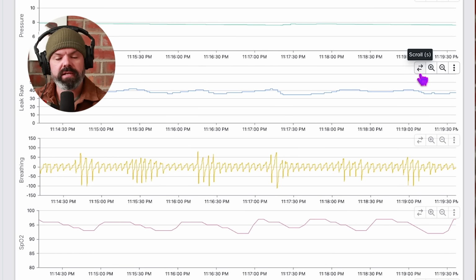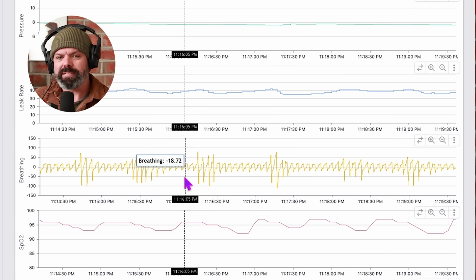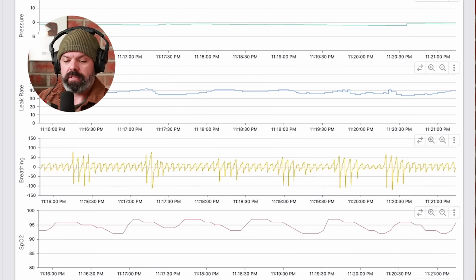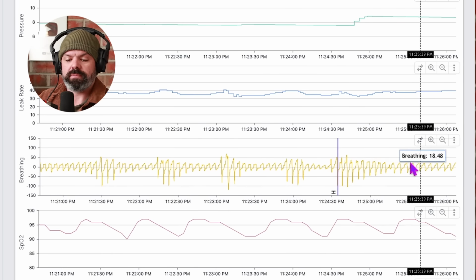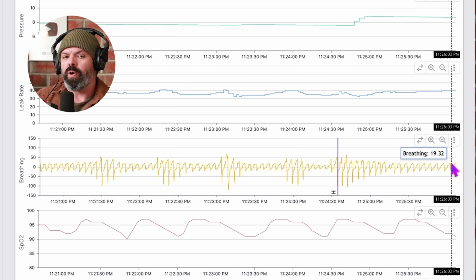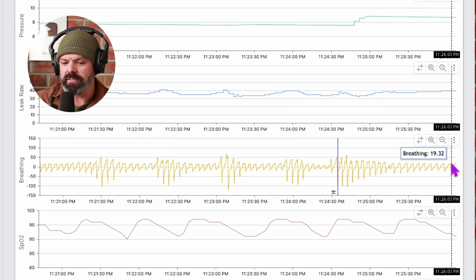I want to show you this here as well. All right, do you notice anything different now that I've scrolled forward a little bit? We've got the same breathing here. You can see the shallow breaths followed by the big breaths, but what's missing? The flags, okay? There's no more hypopnea flags. There should be one here, here, here, here. If we scroll forward, look at them. Here, here, here. They're all gone. Oh, there's one here. You can see the blood oxygen's the same. Drop, coming up.